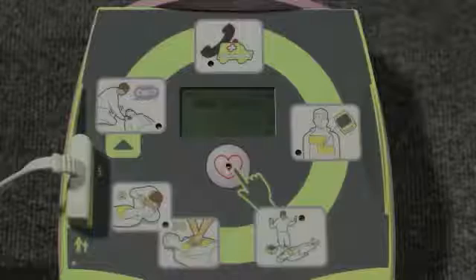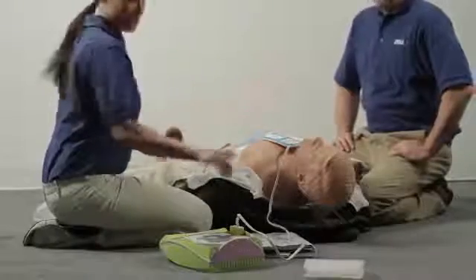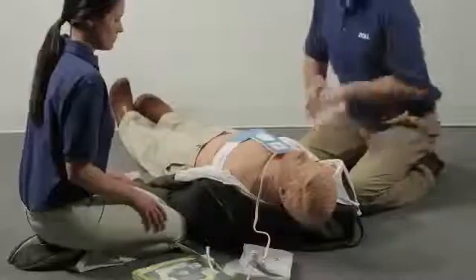Shock advised. If a shock is needed, be sure that no one is touching the person. Press the flashing shock button. Everyone clear? After the shock is delivered, immediately put your hands on the CPR landmark and start CPR.